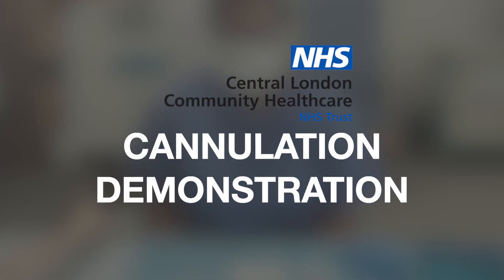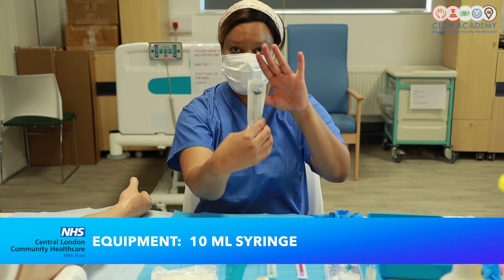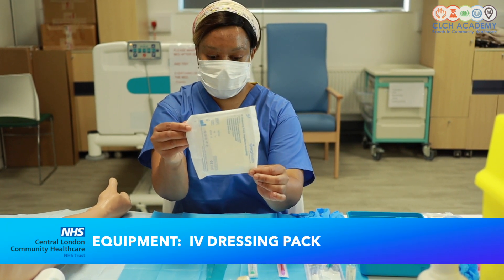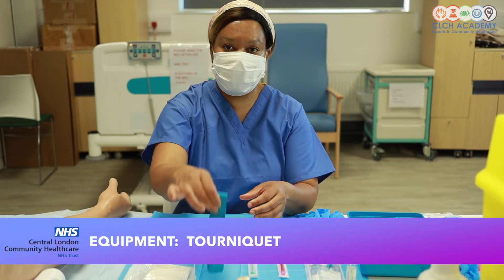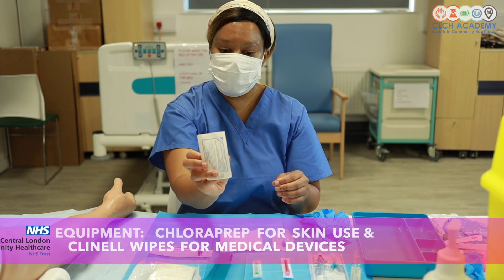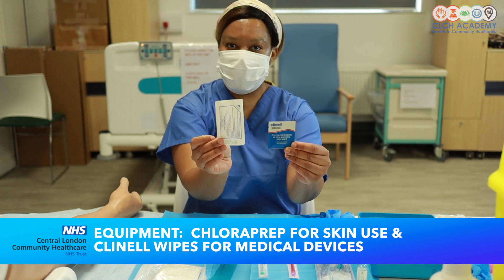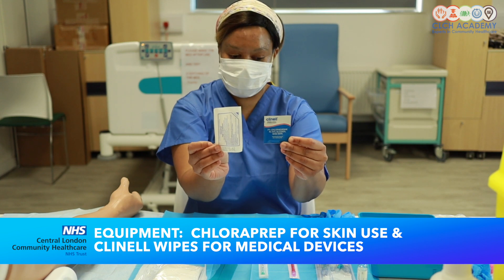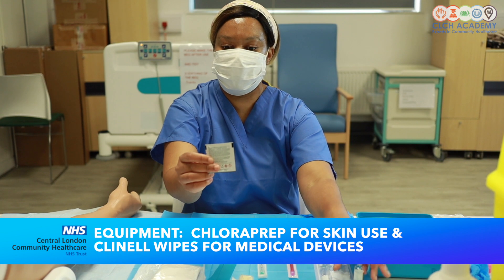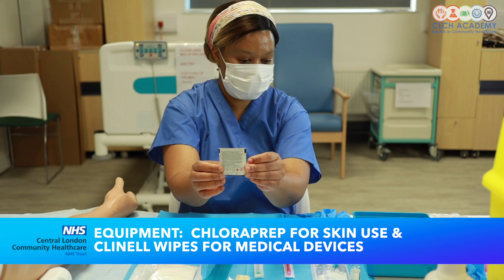For this skill you will need the following equipment: obviously a 10 ml syringe, an IV dressing pack, a tourniquet, some chloroprep — you've got the license for skin use and skin preparations — 2% chlorhexidine and 70% alcohol, as well as the license for medical devices skin preparation, also 2% chlorhexidine and 70% alcohol.